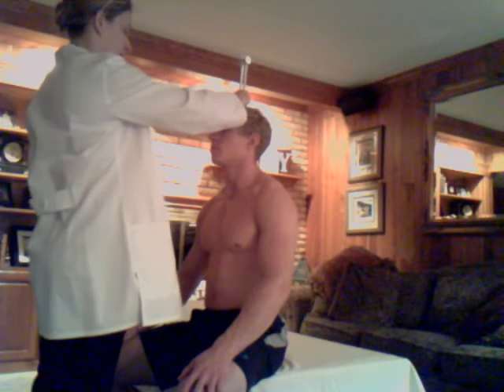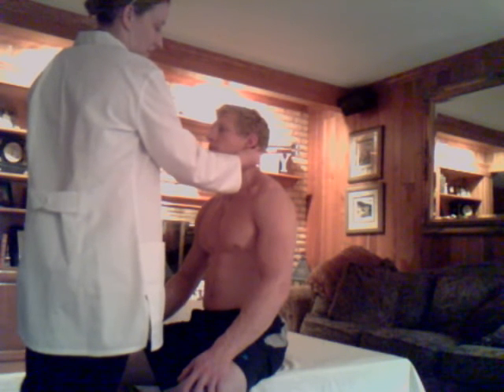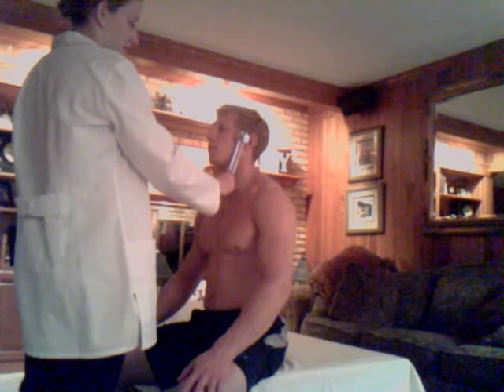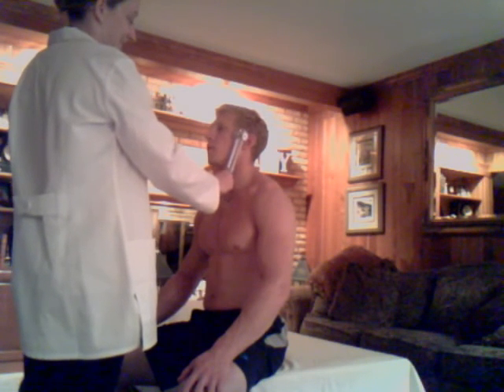Next, we will check your hearing. So I'm going to tap this tuning fork, and I'm going to place it on the top of your head. I want you to tell me if you hear it in your right ear, your left ear, or both ears. Both. Okay, I'm going to tap it again and place it behind your ear, and I want you to tell me when you no longer hear it. Okay. Now I'm going to place it in front of your ear, and I want you to tell me when you no longer can hear it. Okay. Good. Air conduction should be twice as long as bone conduction.